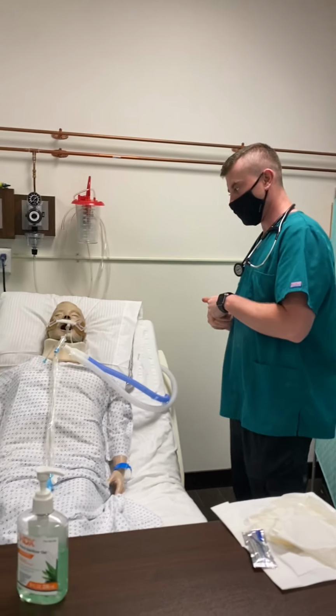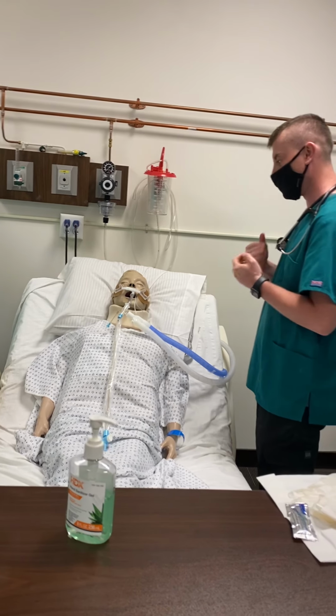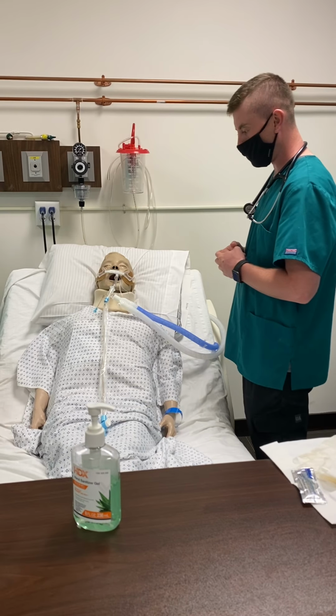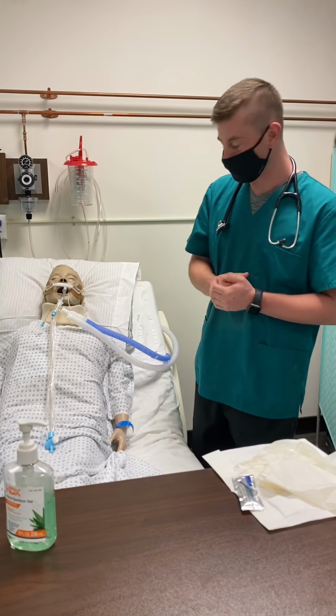I'm just going to get this set up real quick and we'll get started. I'm going to be going through your nose. It's going to come down your throat. It might irritate you. It might cause a cough. And that's when I will proceed to suction.